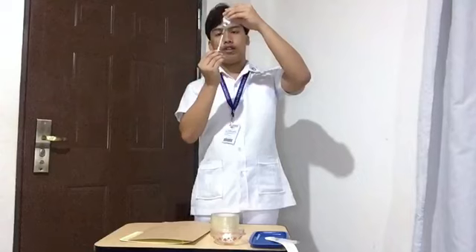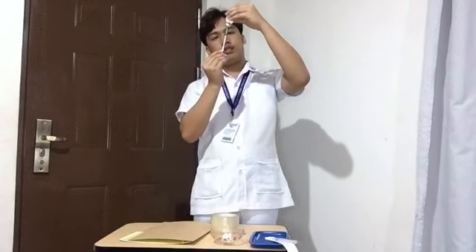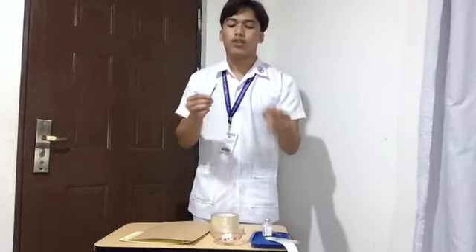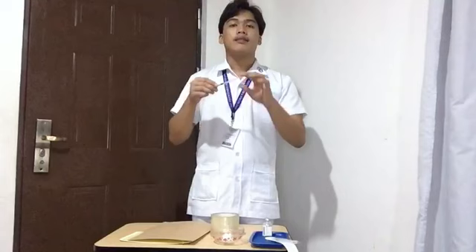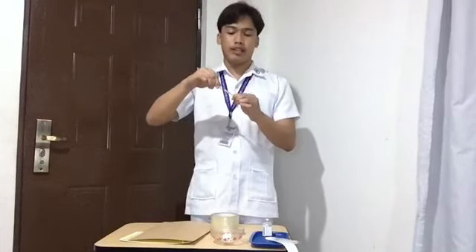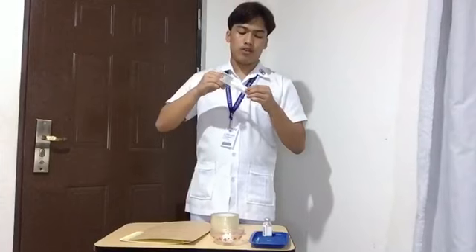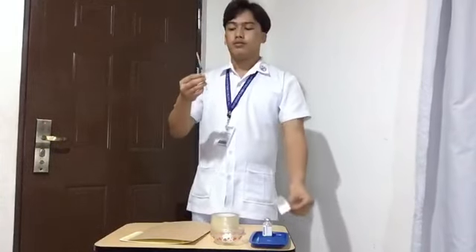So I'm going to invert it, and okay, I am going to recap it and replace the original needle. So I am going to insert the original needle.